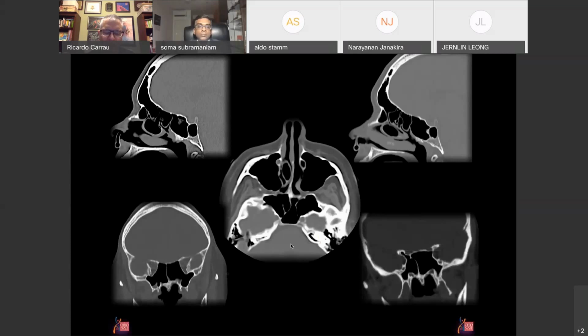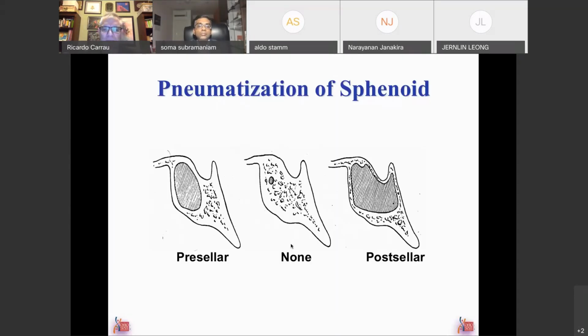So if you have something that has pneumatized like this, I think that your corridor will be fairly easy because nature has done a lot of the corridor for you. In patients with highly pneumatized sinuses, you just have to remove the septations in between, the walls in between, and you have an ample corridor. Now, we know that that's also variable.